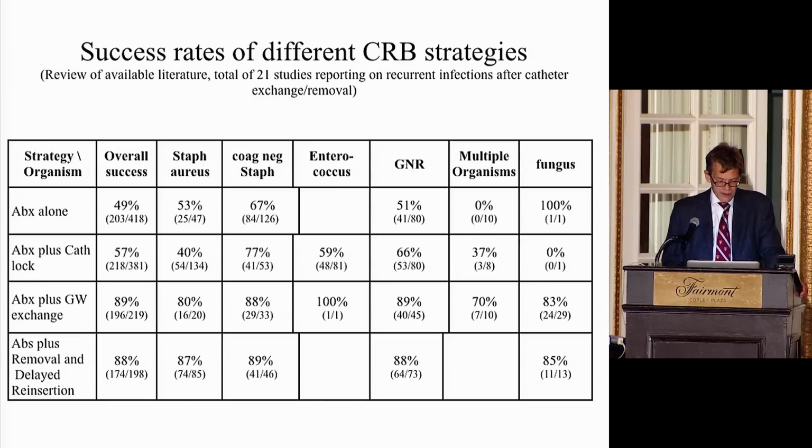If you have catheter-related bacteremia, the interesting thing is, and I think as a nephrologist, we always have to try to advocate for our patients, and we think of the concept as preserving vascular access sites. It's well recognized that veins thrombose if you have a large dialysis tunneled catheter inside over a long period of time or repeatedly. So we lose access sites. So exchange of infected catheters over guide wires, with or without disruption of the fibrin sheath, can preserve venous access sites while effectively treating the infection.